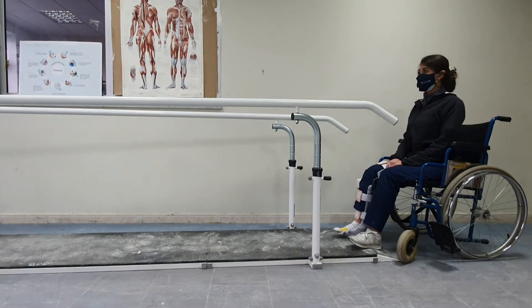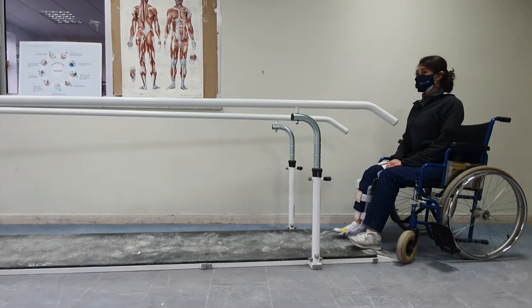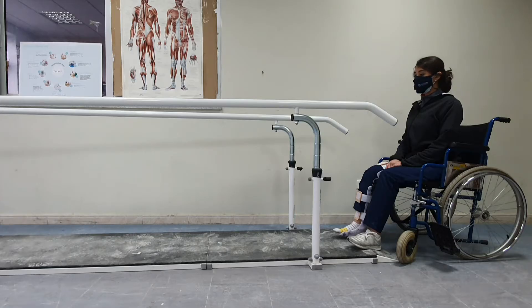We will start gait training between parallel bars, teaching the patient all the activities between the bars. Once the patient masters these, we will do the activities using crutches but still between the parallel bars, so the patient can lean on the bars if they need it. Finally, we will move to training with crutches outside the parallel bars.